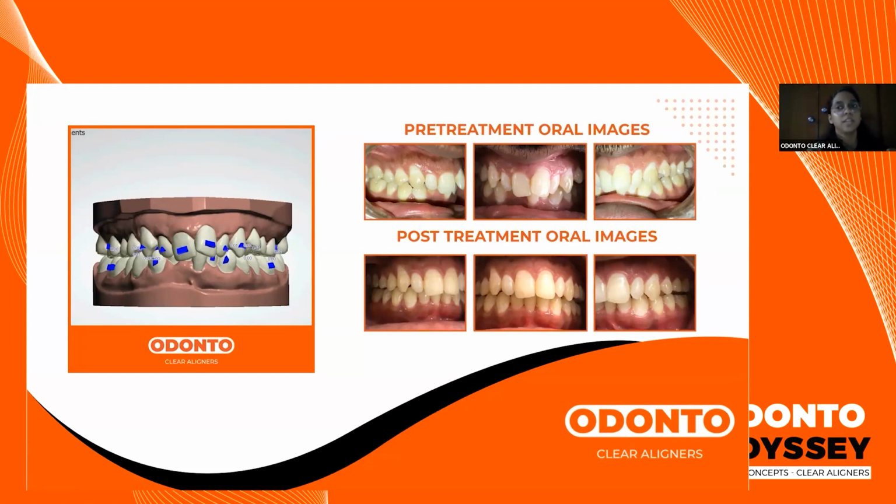If the patient comes with any particular concern, you fill those out specifically in the form, so that when we sit down to plan, we know what your patient is looking for. That helps with better communication, so that right at the first plan you receive, we try to give you a plan that is exactly what your patient is looking for. So when you fill that out, it helps, and we will help you with how to go about it.